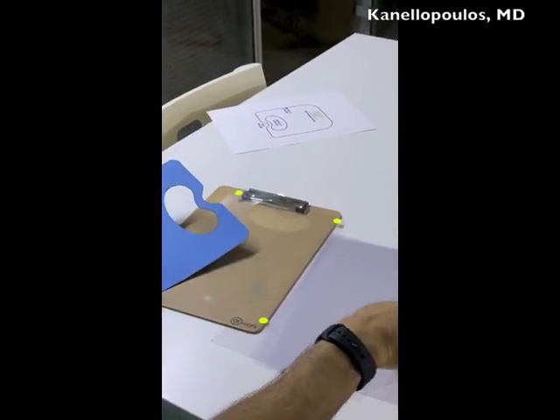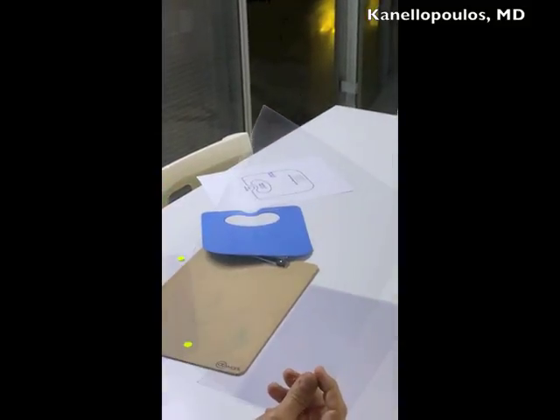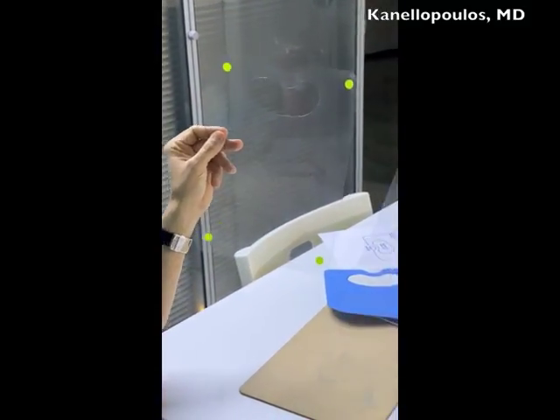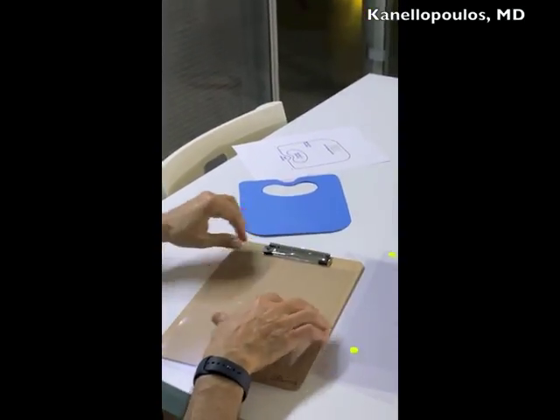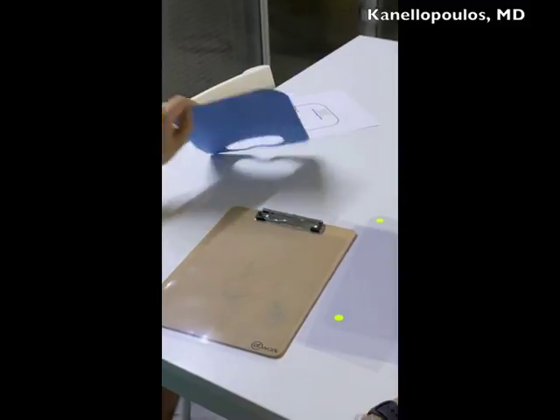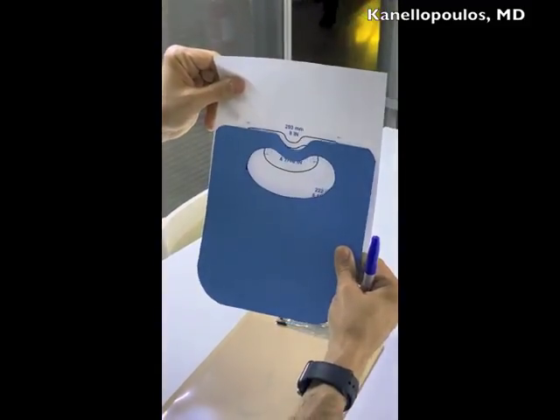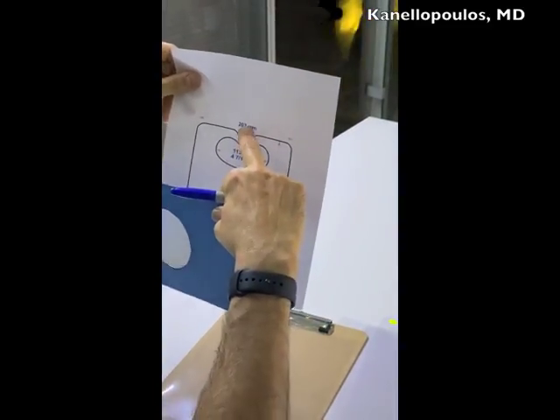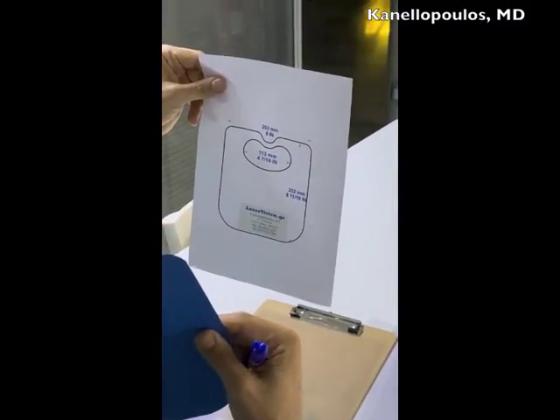So we're using some clear cellophane covers, as I mentioned before, and all we need to do is produce our slit lamp protective cover from a clear cellophane cover that we can find commercially available at any copy shop. So we're taking our template. We actually decided to go about an inch lower than the actual template and create a larger margin superiorly to protect more the clinician's eyes.